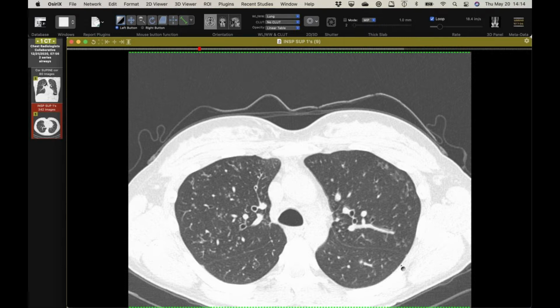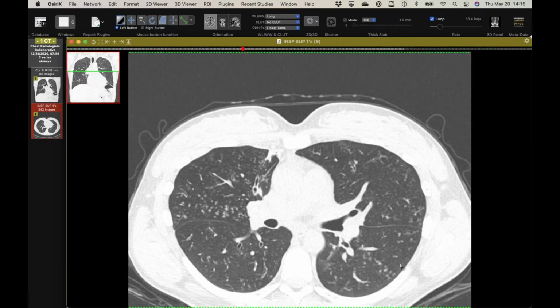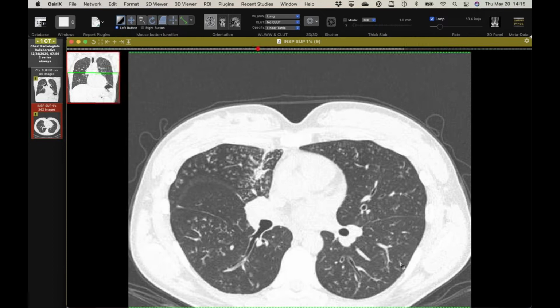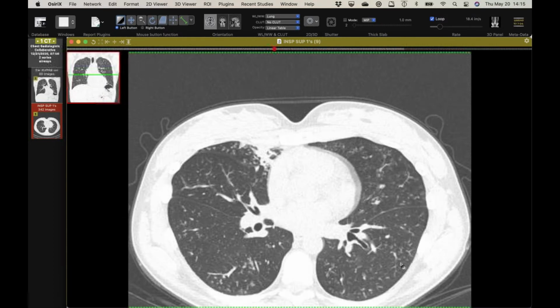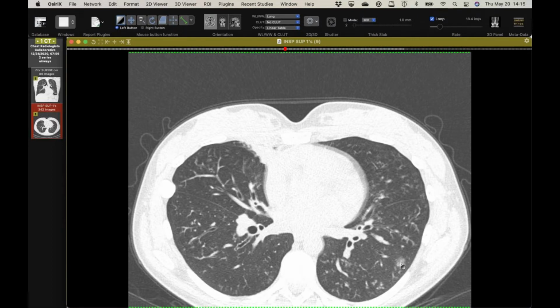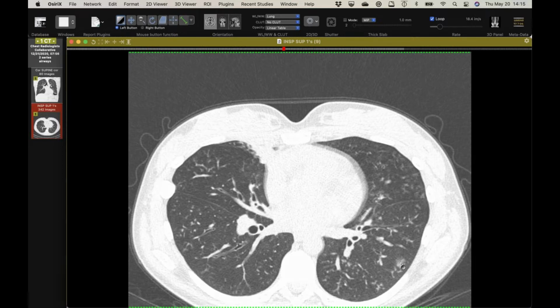And then, I mean, this would be a great look on imaging for diffuse panbronchiolitis, but she's completely the wrong demographic. I know it does occur outside of Japanese males, but it's already a pretty rare disease, and to occur in a 19-year-old white female would be even more rare. So rare times rare is exceedingly rare. Unless she's traveled to Asia, because there are Caucasians that get it. Right. But I don't think she's left the Midwest from what I could gather.